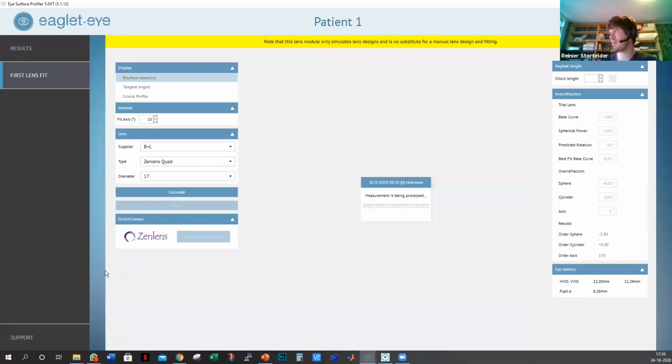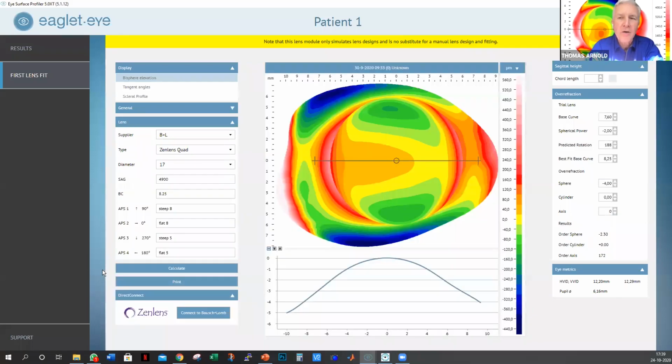Give it another 30 seconds. I'll give a shout out to Gloria. Hi, Gloria. This is Tom. Also, when they do the bi-elevation lens, which is really cool, which is more of an oval optic zone, it'll have the sag in the optical zone, and that carries through into the haptic as well. So that's a very, very good lens for complicated eyes.